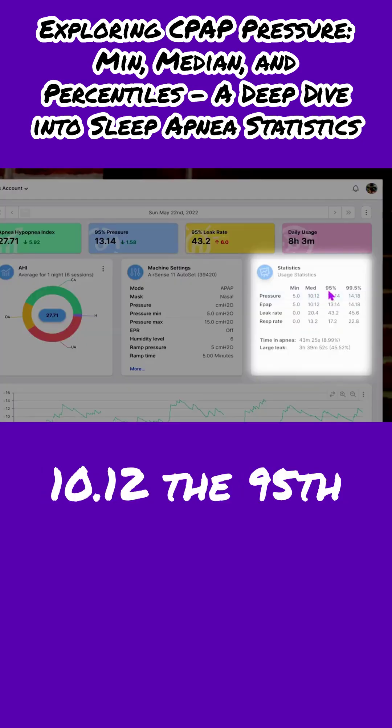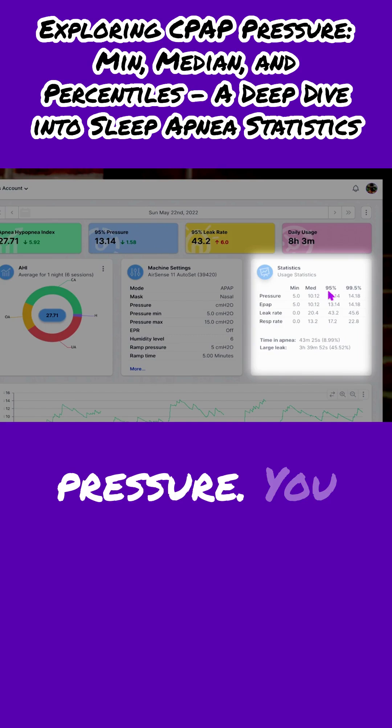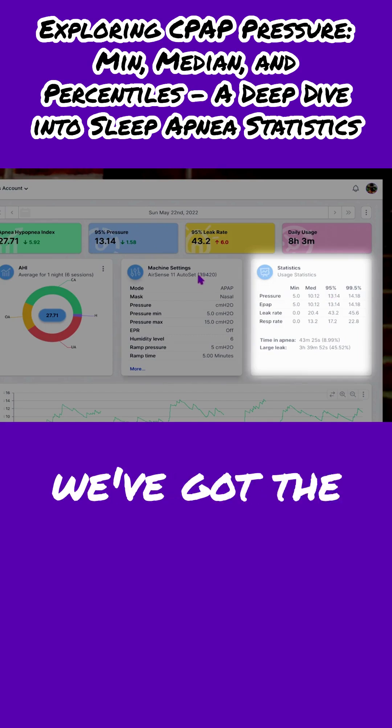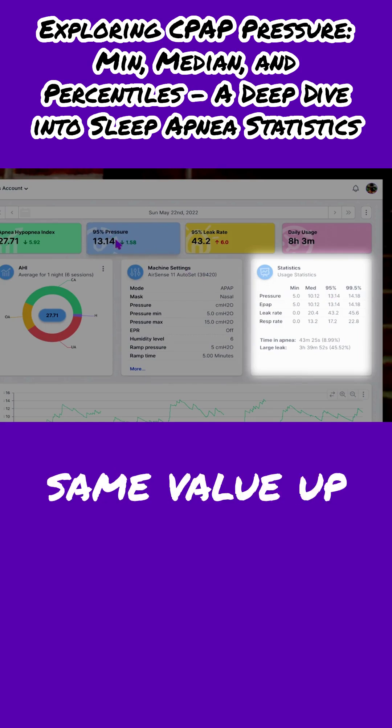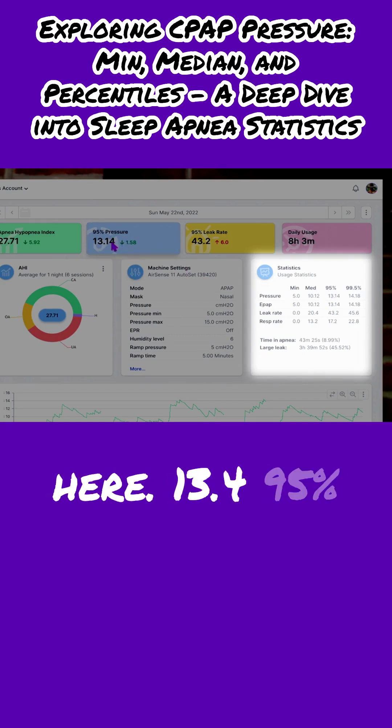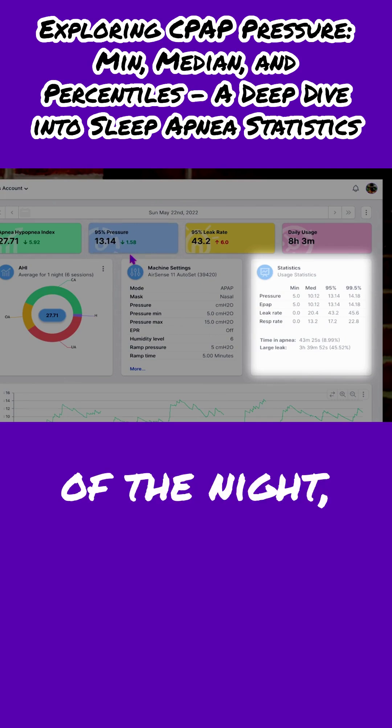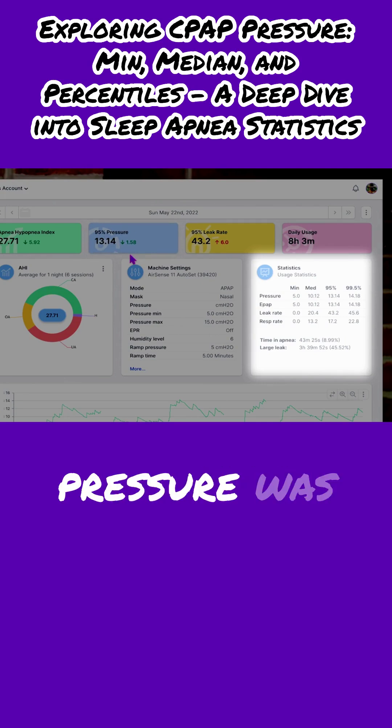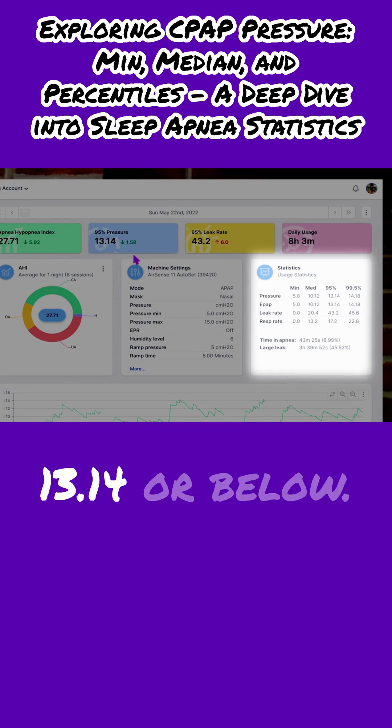The 95th percentile pressure, you guys already know that. We've got the same value up here, 13.14. 95% of the night, the CPAP delivered pressure was 13.14 or below.